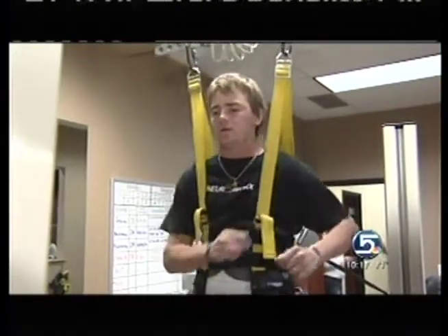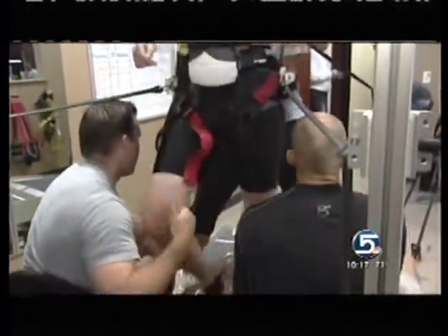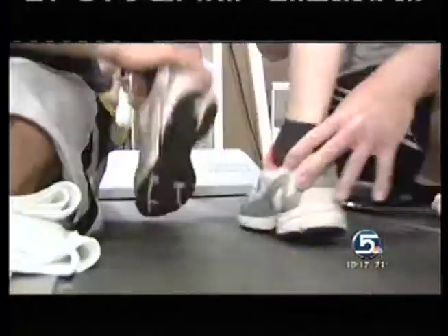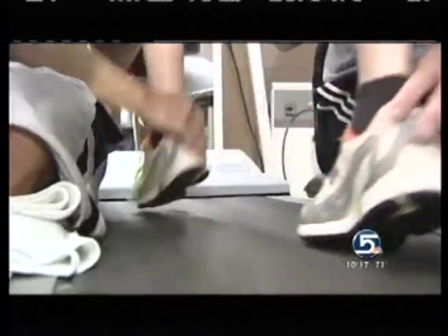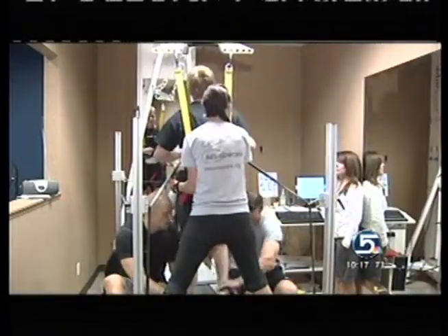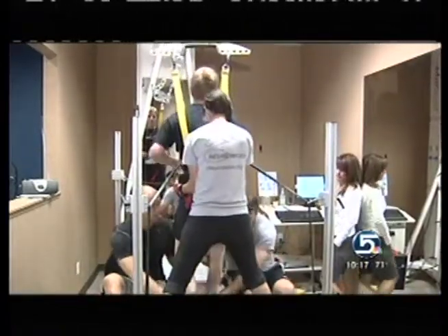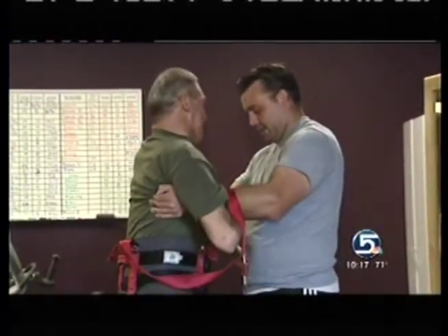Jared even duplicates swinging the arms in opposite directions, again an unconscious pattern when we walk. The message to the spinal cord memory? So here's the sensory input. Figure out how to make it work, how to make these reflex responses stand, step, and walk. It doesn't work for all paralysis victims.